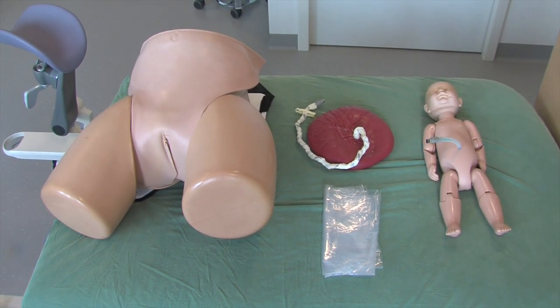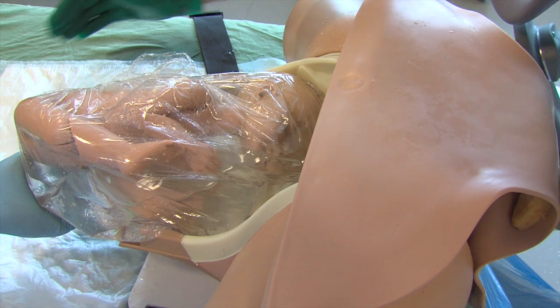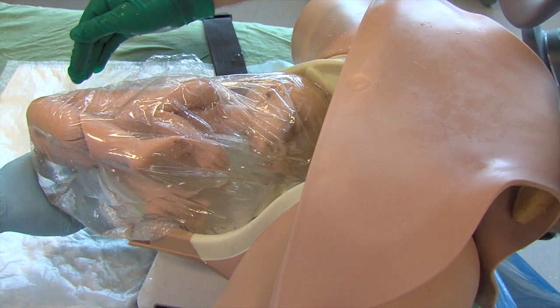If one wants to enhance realistic sensations, the procedure can also be trained with a waterproof model. The fetal manikin is then positioned in a plastic bag filled with lukewarm water.